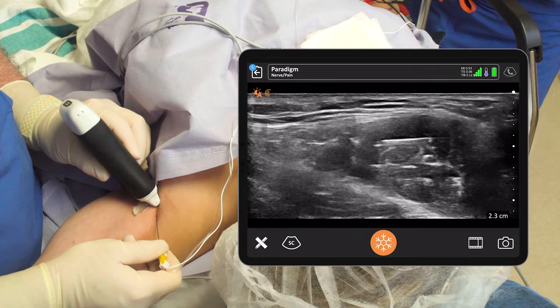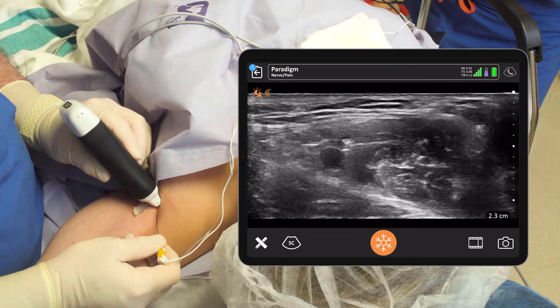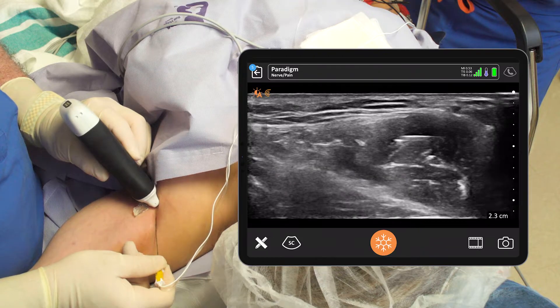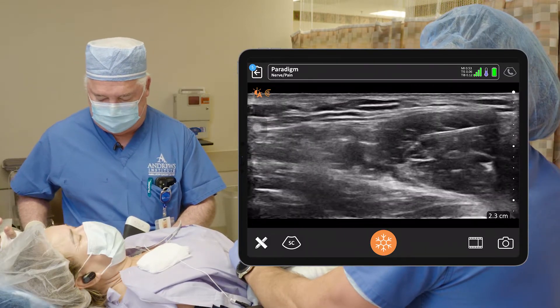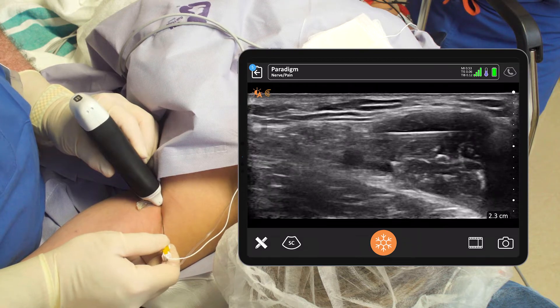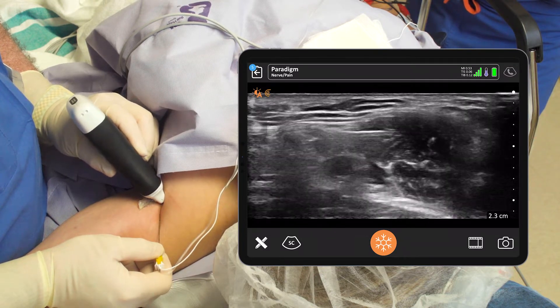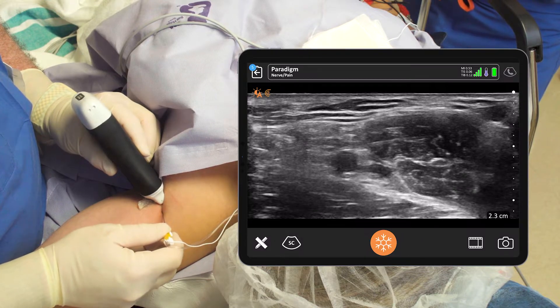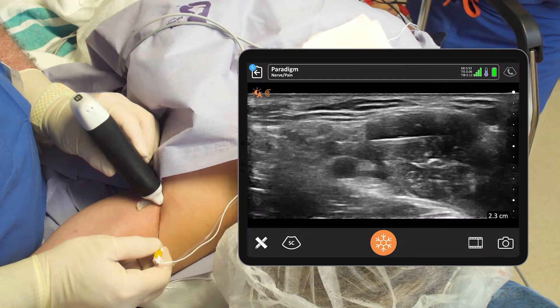Then we're going to go back up on top and see if we can find the median nerve — should be about right there. Not getting a twitch. Go over the top of that — there's our twitch. So there's a median twitch right there. Give me five. What that'll do is push the nerve out away so you can advance your needle a little bit more. Then we'll come back and go under that nerve closer to the artery. Give me about three right there — we'll put three on the underside. I got a little twitch again.